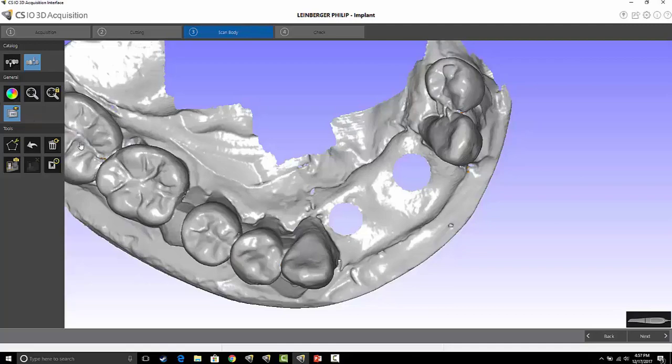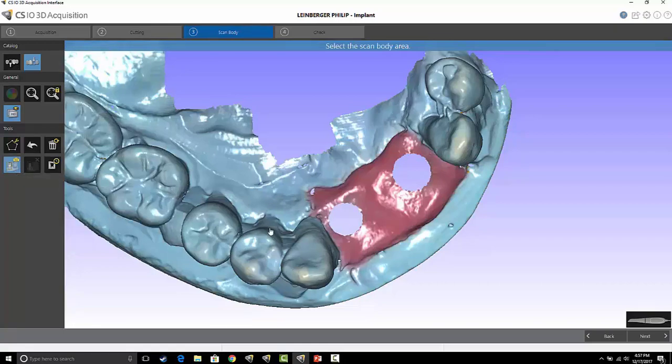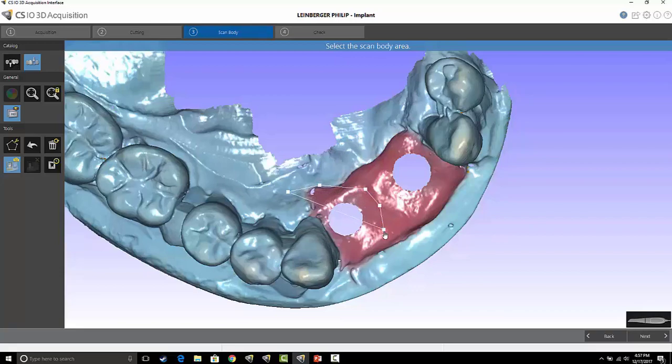Down here's my scan body area selection. When I highlight this, I can actually create an area on my scan model here, and that's going to isolate where I can scan and turn blue the rest of the scan.